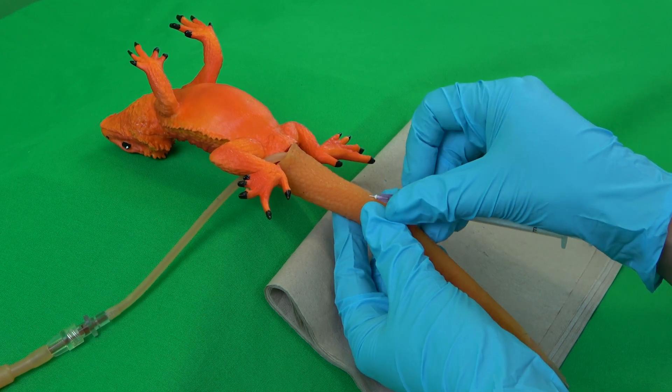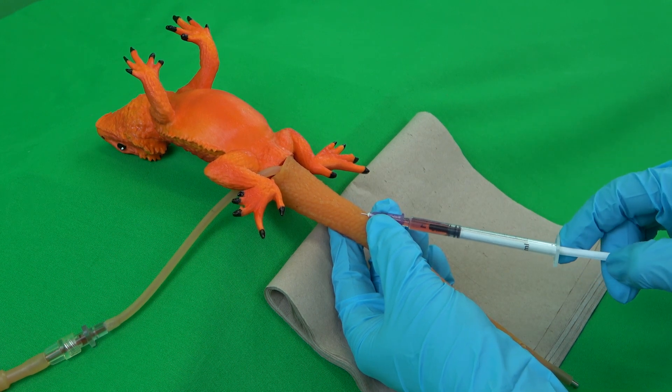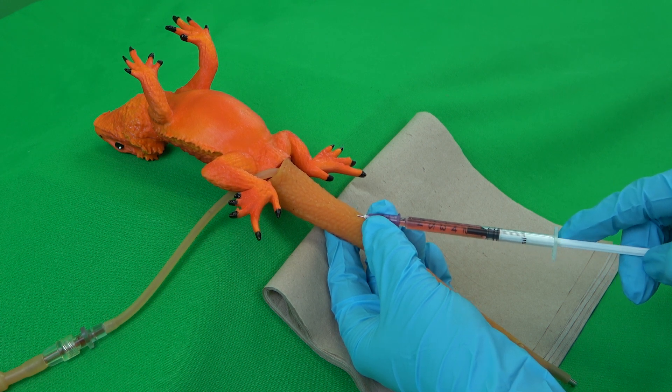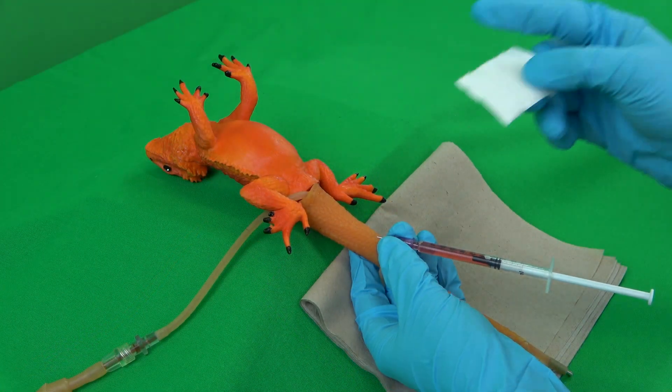While taking the blood sample, the cannula hub is to be fixated between the thumb and index or middle finger of the non-dominant hand. If the vein has been successfully punctured, the desired amount of blood can be taken. Often, no more than 0.5 mL are needed, depending on the measured parameters.